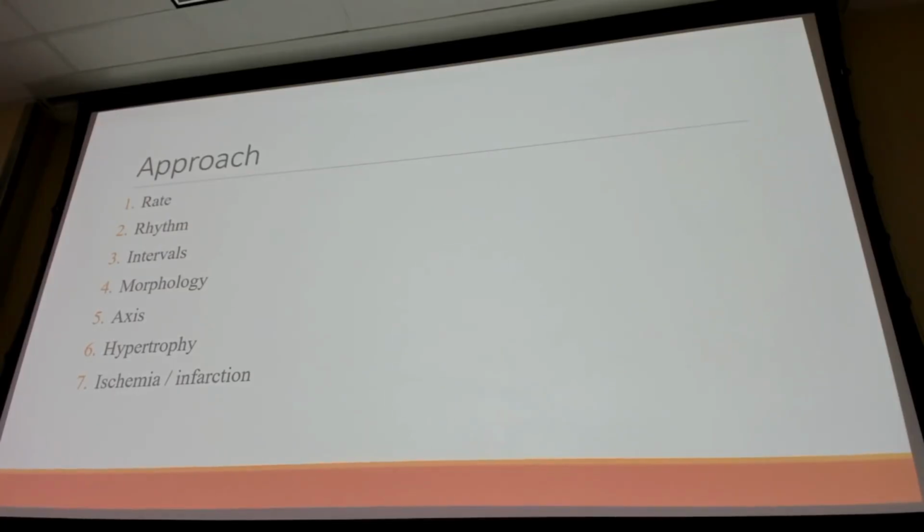Everything else on an EKG could be helpful if we're worried about something like left ventricular hypertrophy, maybe they have heart failure. They're subtle indicators, but nothing you can really hang your hat on. For us, we're worried about anything that can kill that patient. So infarction's the big one, and then any sort of arrhythmia like VTach, AFib, and if you remember those syncope lectures, delta waves for WPW, heart blocks, long QT. We'll talk about it a little more throughout the lectures.